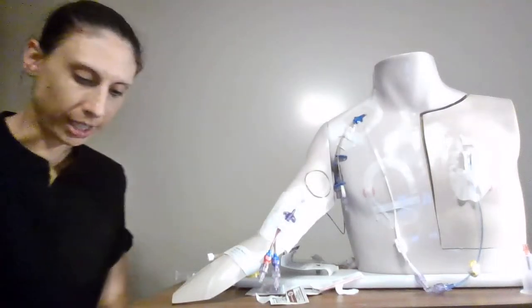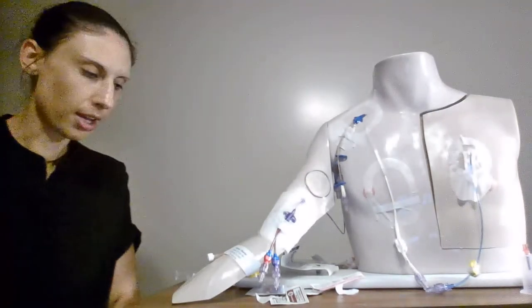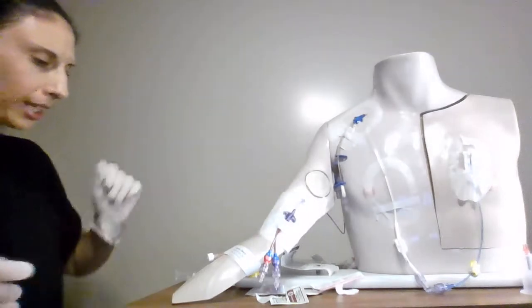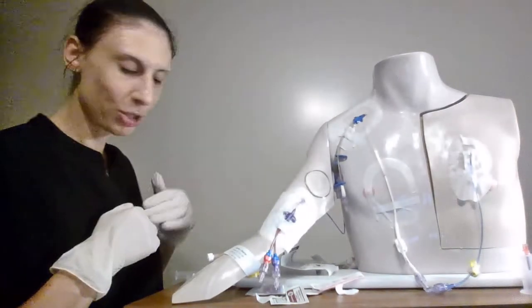So after I've done my hand hygiene of course I'm going to put on a pair of gloves and they're non-sterile just regular gloves. Of course I would introduce myself and tell my patient what I'm going to be doing.